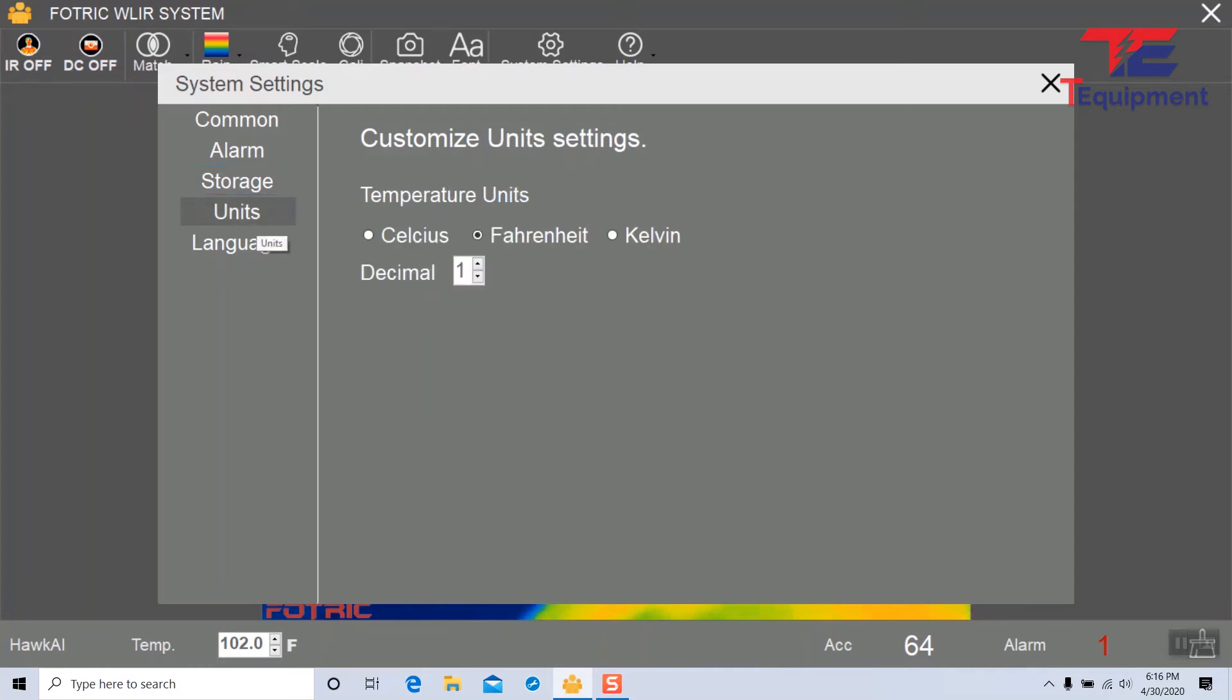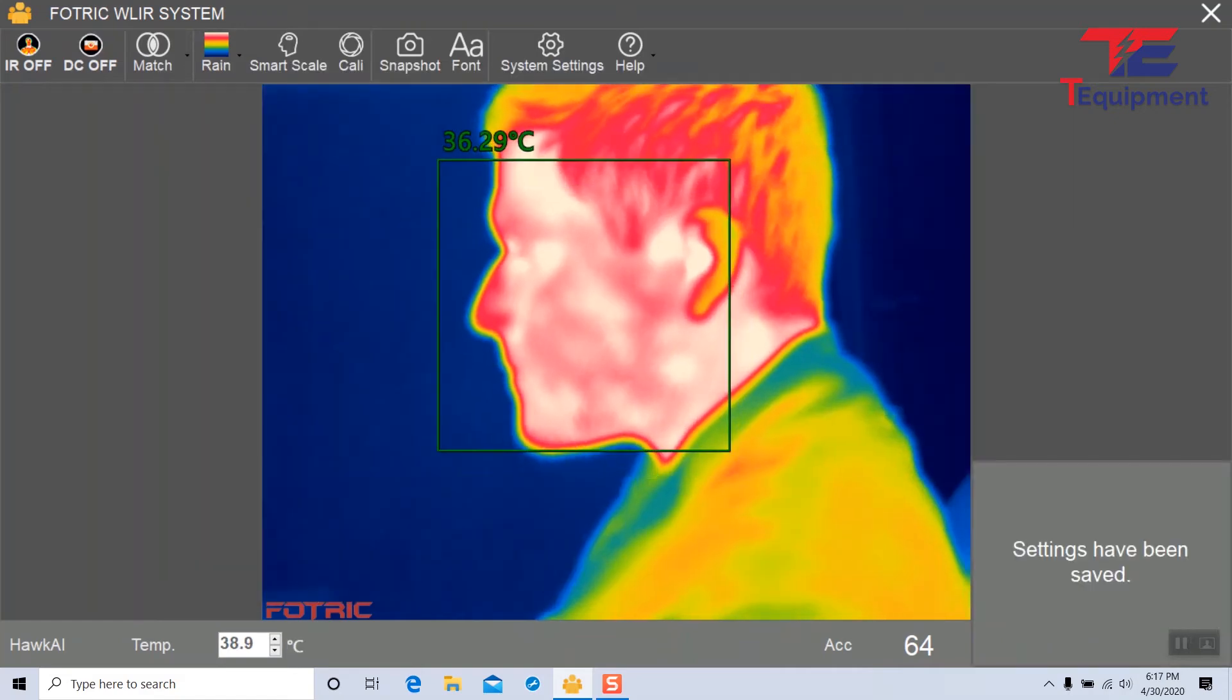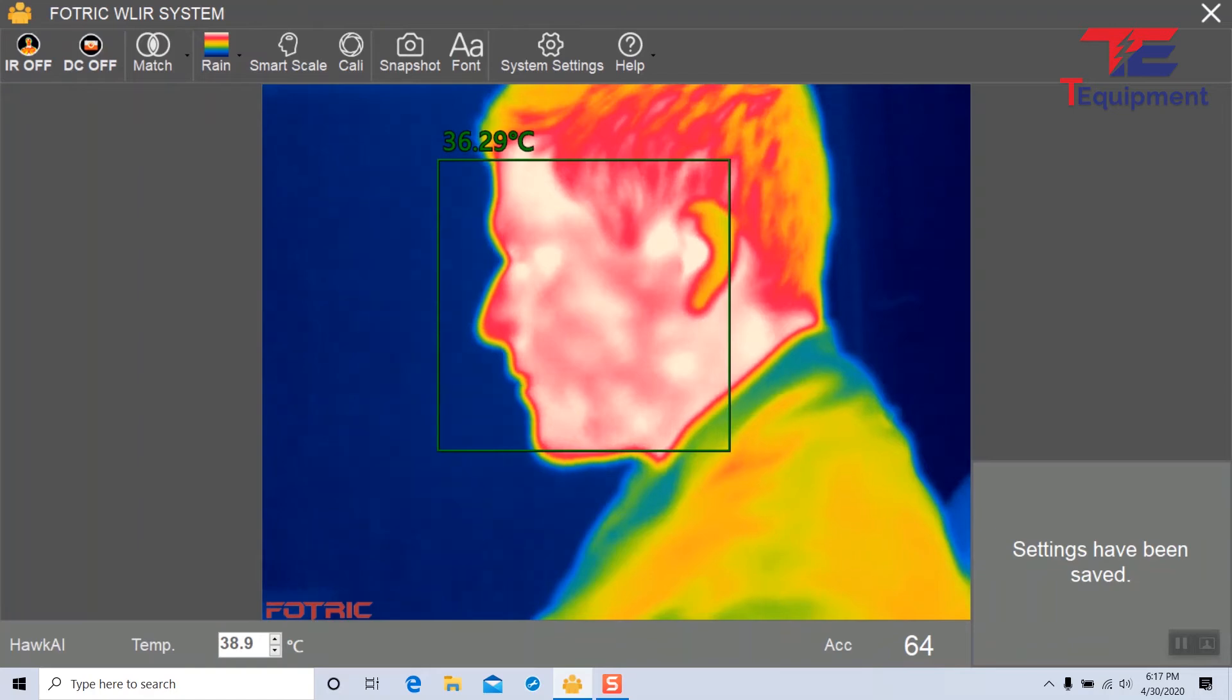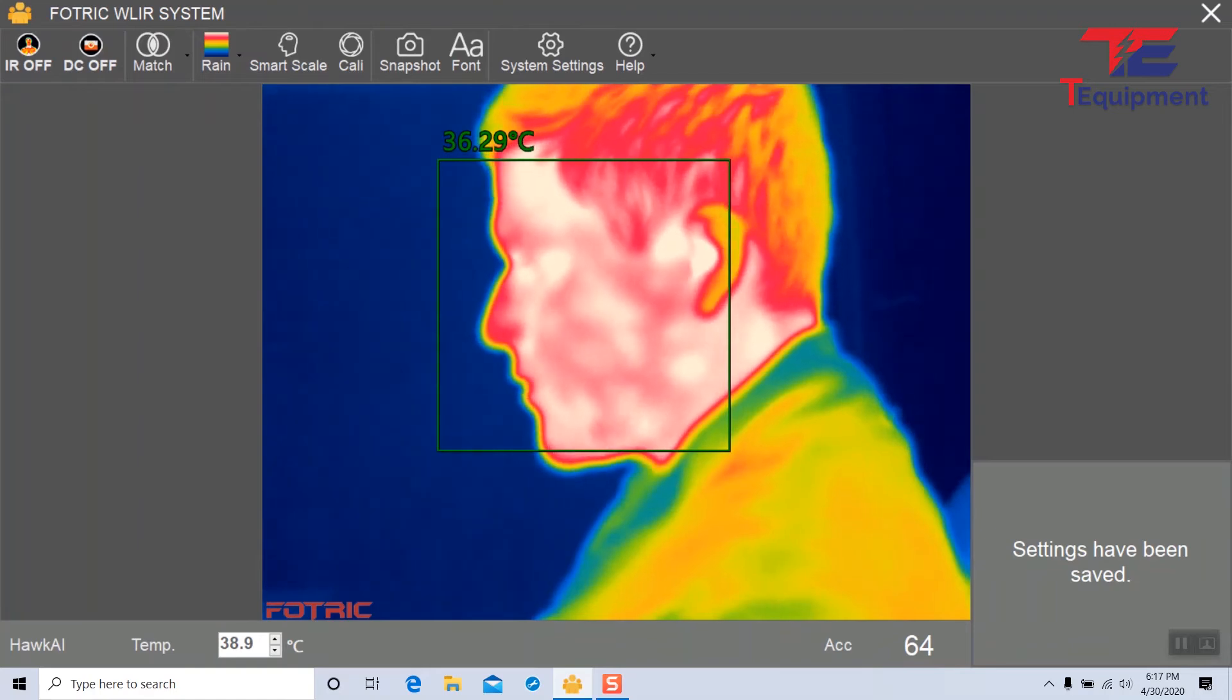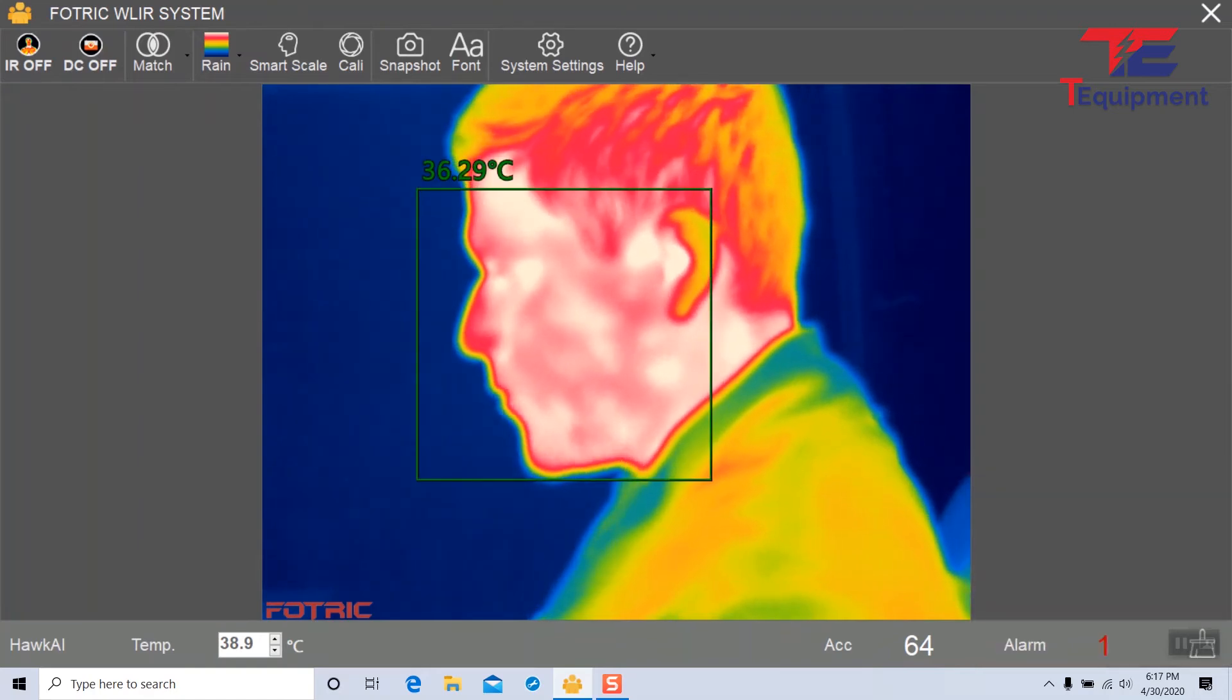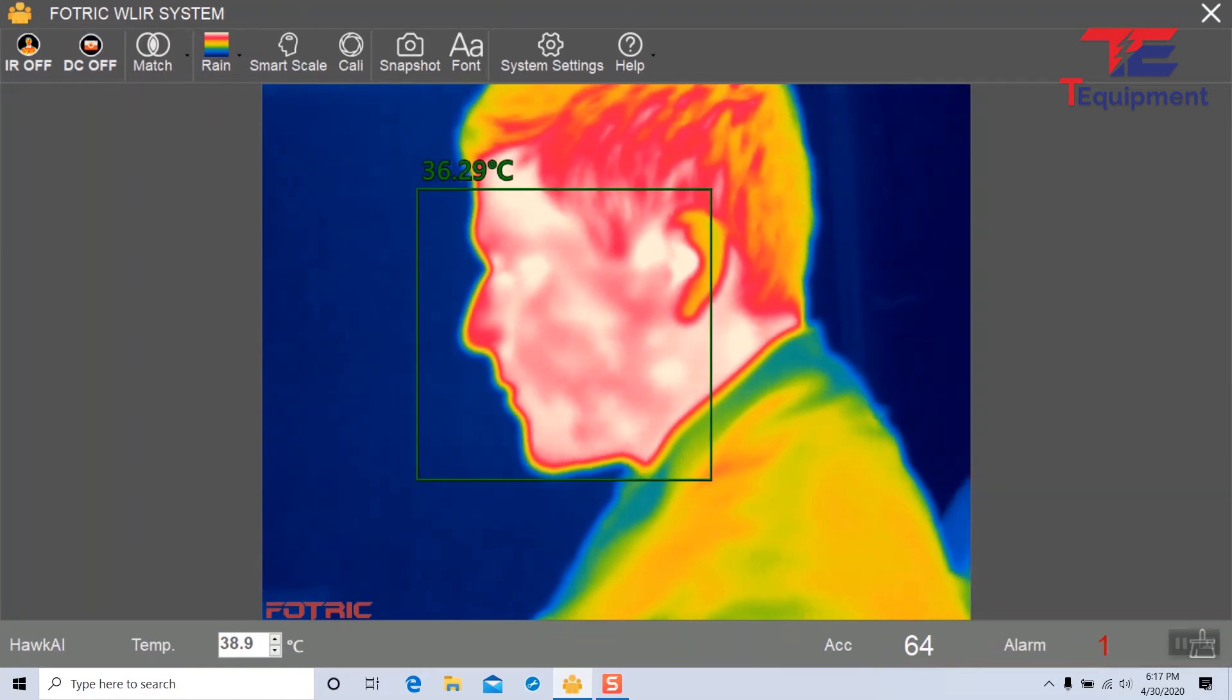You can also set the units under Celsius, Fahrenheit, and Kelvin as well as the number of decimal places. I'm going to go ahead and do Celsius and decimal so you can see this. Now you can see that showing 36.29 degrees Celsius.